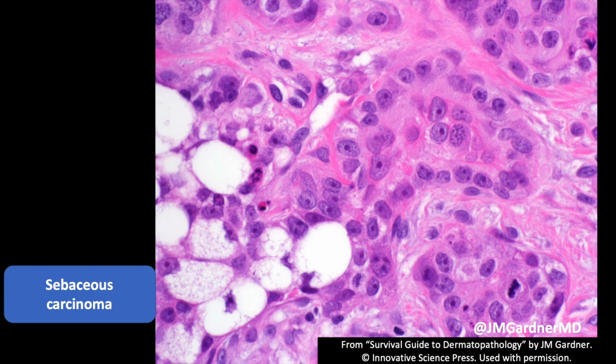I'm making it look a little more simple than it is in this lecture because I'm showing you select, very good pictures of classic examples, but I've certainly encountered many cases in real life where I wasn't totally sure. If I see a carcinoma that's a little bubbly, but I'm not sure it's sebaceous and the stains don't quite pan out, I'll usually say this is a carcinoma, probably a basal cell or maybe a basaloid squamous carcinoma, but I can't be totally sure it's not sebaceous. The goal there is that hopefully they will treat it more aggressively and make sure it's completely excised with negative margins. But in any case, you can go into that paper and we'll talk about it in a little more depth there.